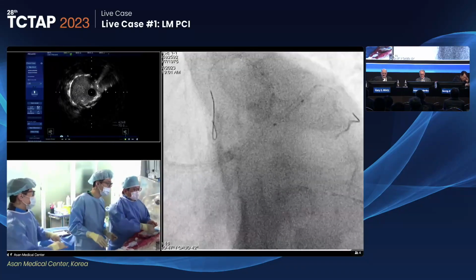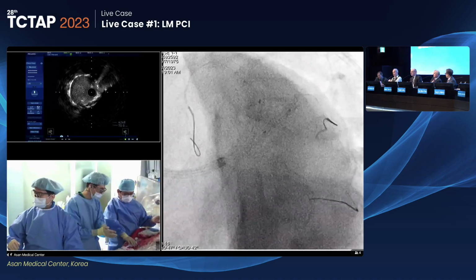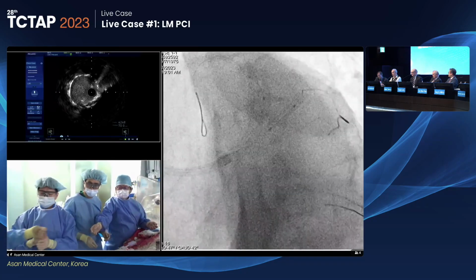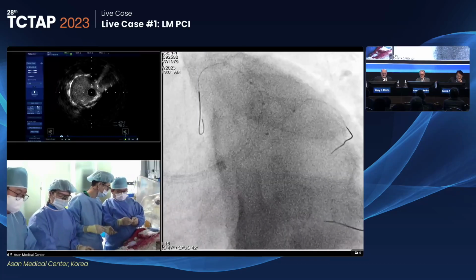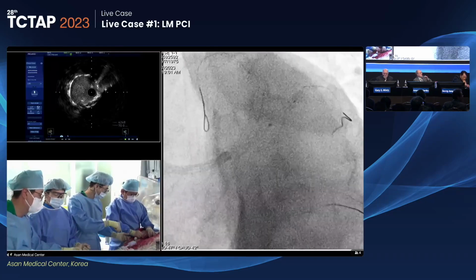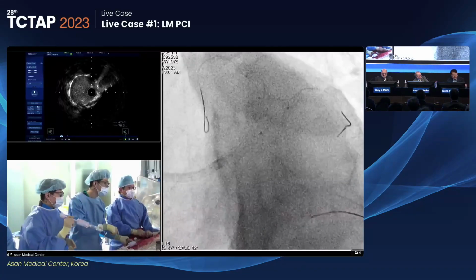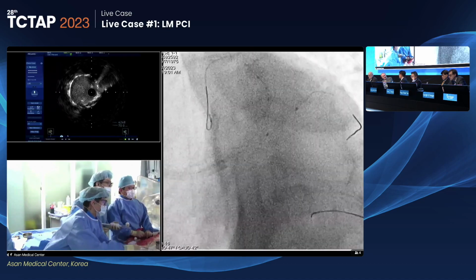I must say I agree with Antonio, though. I would have tried to limit the amount of stent you end up with, because it does incur a penalty to the patient forevermore. The intermediate could have been treated with a DCB easily in this case. No matter how you cut it, we're going to end up with a somewhat compressed ostium of that stent. George, if you do FFR on the circumflex with a lot of diffuse disease distally, it's going to be positive anyway.